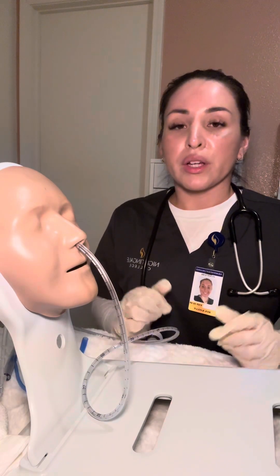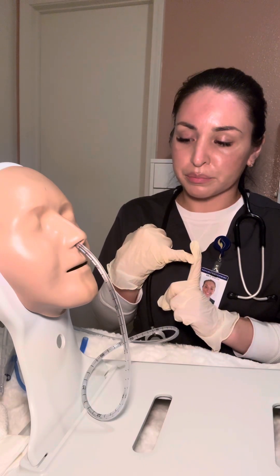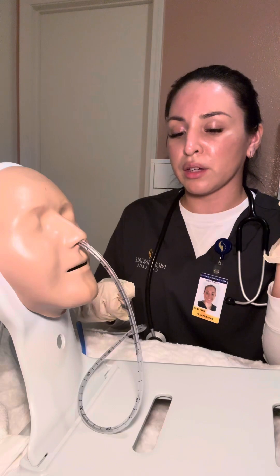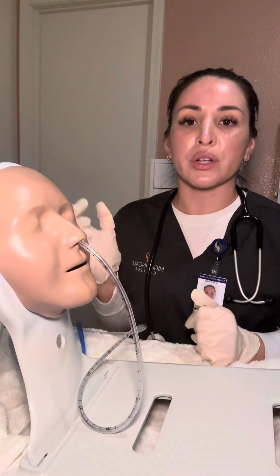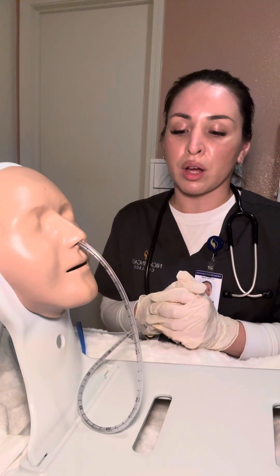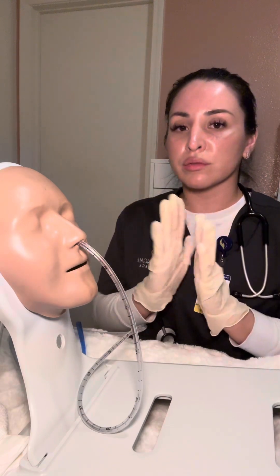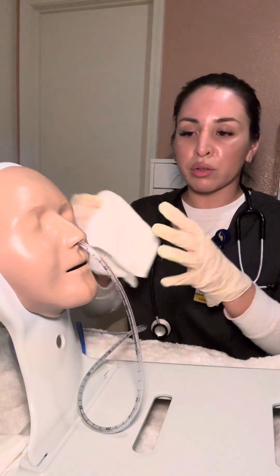We're going to document the amount of suction obtained, which side nostril was used, the length of tubing and depth inserted, and the suctioning pressure — whether it's intermittent or continuous. We also document the characteristics of the aspirate: color and amount. Once everything is documented, we're going to clean everything up and offer the patient a towel if needed.